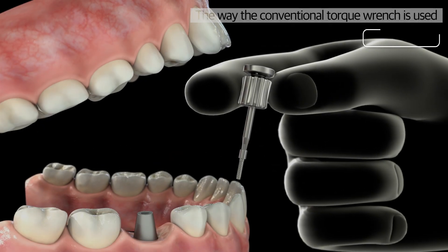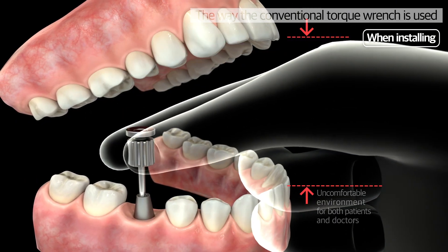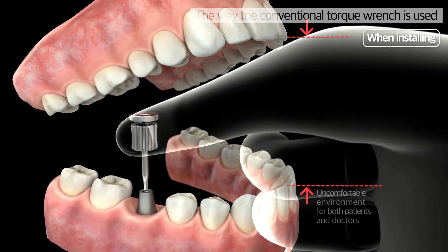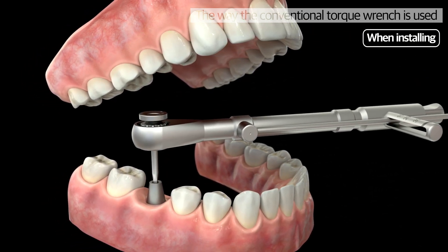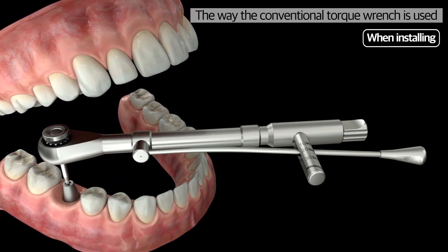Conventional Torque Wrench requires practitioners to put a hand in the patient's mouth when using it, which increases the difficulty and discomfort when a patient has a small mouth or a dentist has a big hand. They also have various disadvantages, such as the discomfort of using two pieces of equipment as well as the risk of swallowing a hand driver.